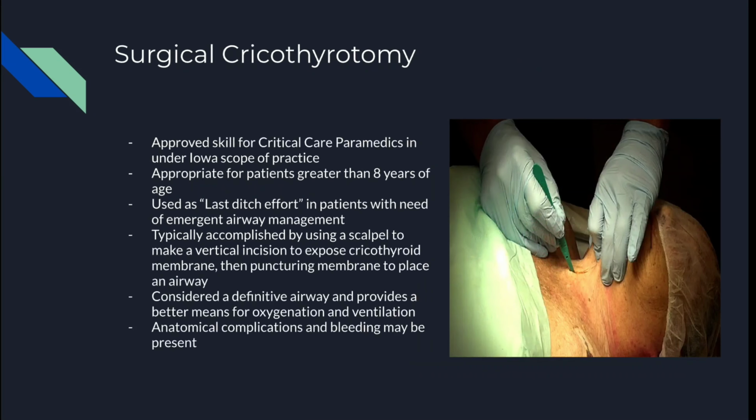All right, so surgical cricothyrotomy. This is a skill that is approved for critical care paramedics under the Iowa scope of practice. So this is something that we've already mentioned. It's appropriate for patients that are greater than the age of 8 years.